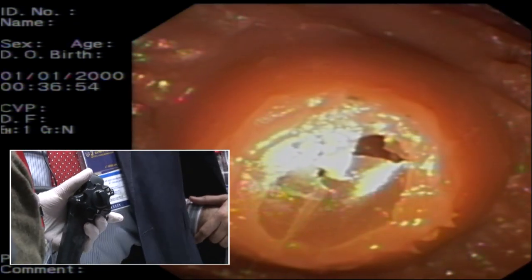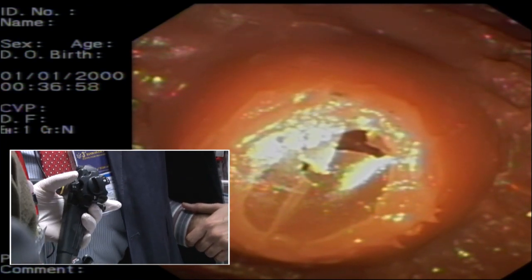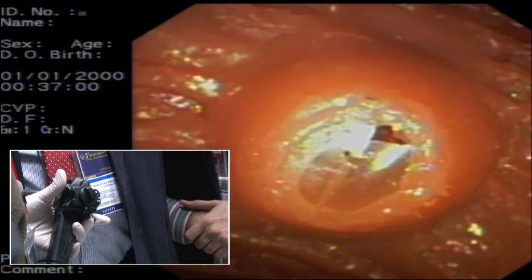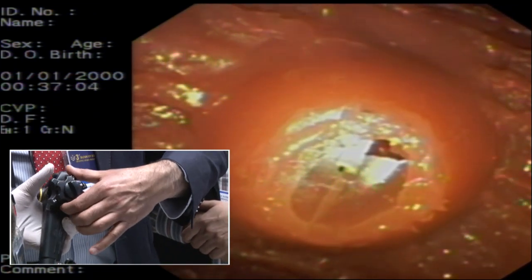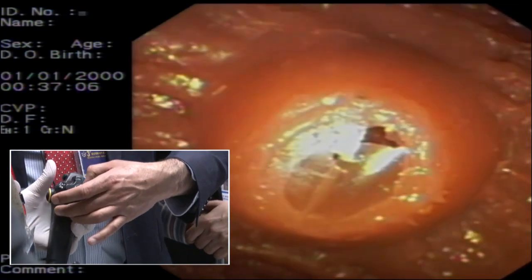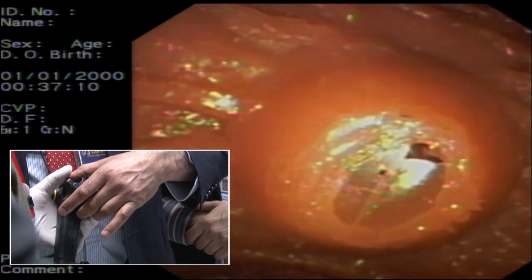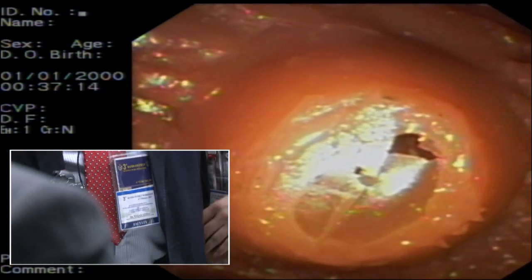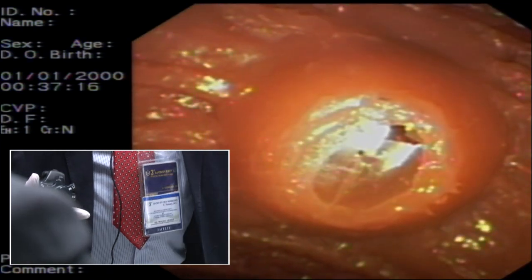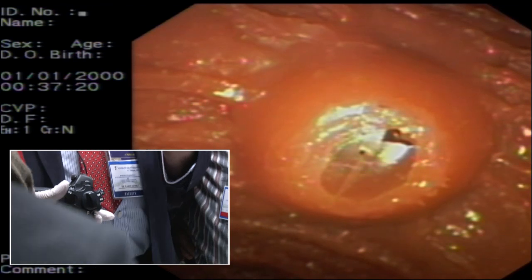अब ये जो है ना ये सही position है इसके लिए cannulation के लिए, ठीक है. You are never too close. थोड़ा सा close आ भी जाए तो आप इसको नीचे कर देना, wheel को up and down ना. It will take it away. ऊपर इसको आप करेंगे ना तो it will bring it closer, ठीक है ना? और अगर आप स्कोप अंदर करेंगे तो it will push it away from you. और अगर आप स्कोप बाहर खींचेंगे तो it will bring it closer to you, ठीक है?